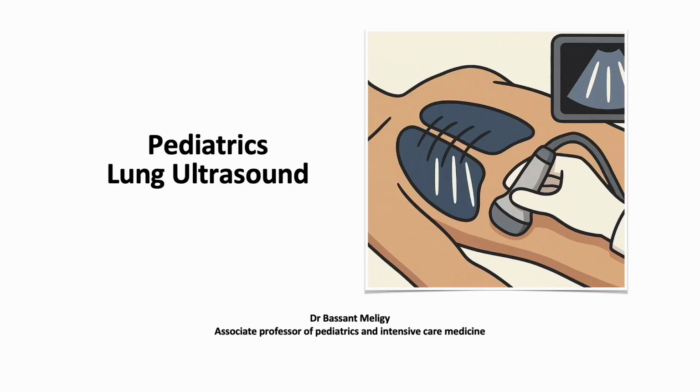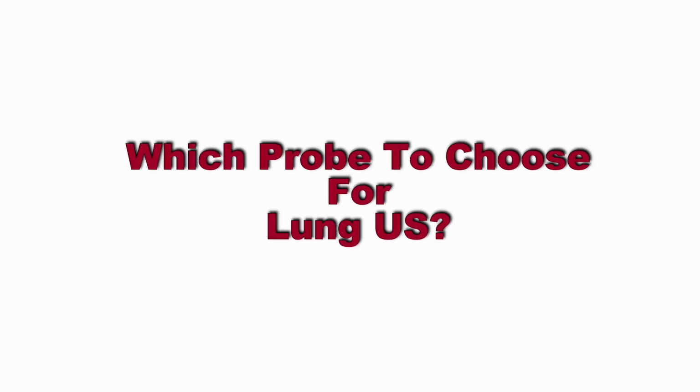Hello everyone. Today we are going to talk about pediatric lung ultrasound. I hope you are as excited as I am to present this lecture to you. I hope it's beneficial for you as we'll cover the basic levels. Image acquisition, and we start with which probe to choose for the lung ultrasound.